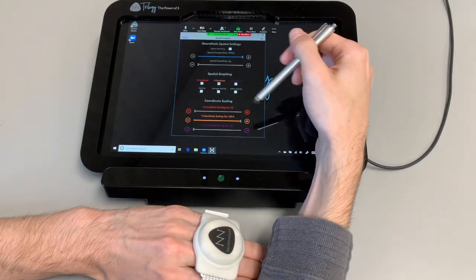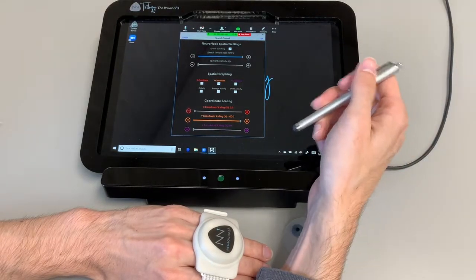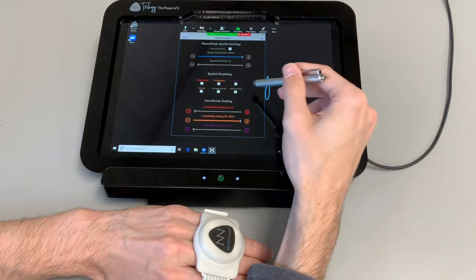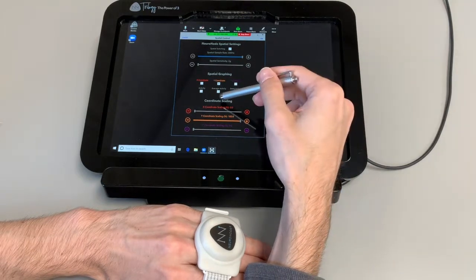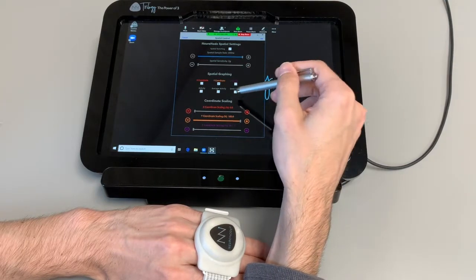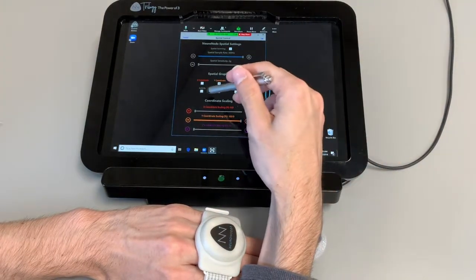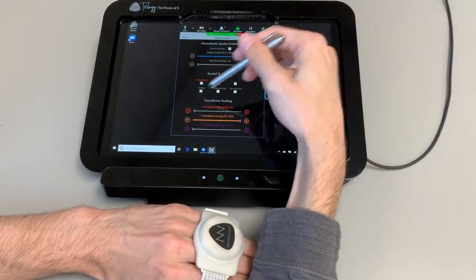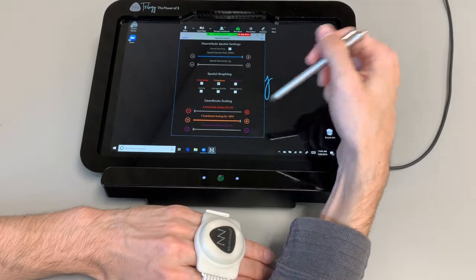And that's all you're going to have on this screen. Your other things here — activity, average activity, and delta activity — these are other display lines. Say like if we had something like we were doing dynamic scaling on the EMG video where it gave you averages over periods of time, or it showed the green and yellow line moving with it, these are going to be somewhat similar. These are going to give you what the actual activity is, what the average of that activity is for the motion, and then your delta activity is kind of the addition of all of these motions together. But we don't need those right now, and for most purposes you can leave those off and just work with the X, Y, and Z coordinates, setting your values for how much of each one you want recorded.